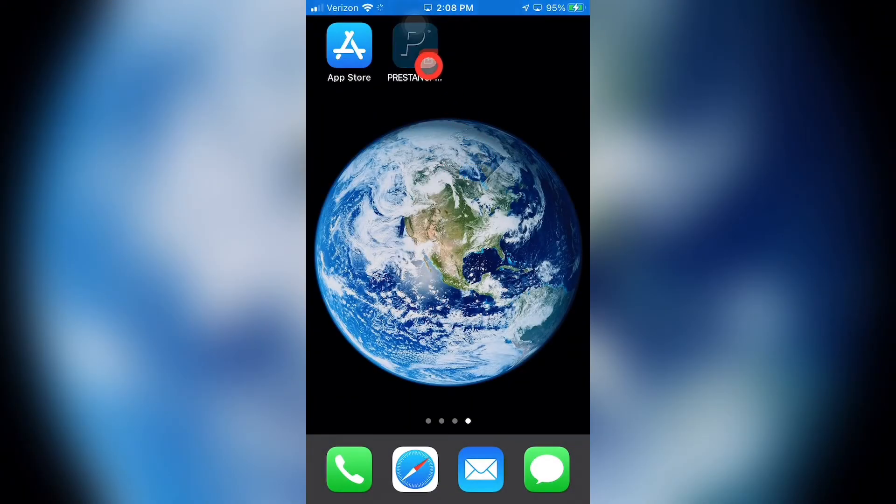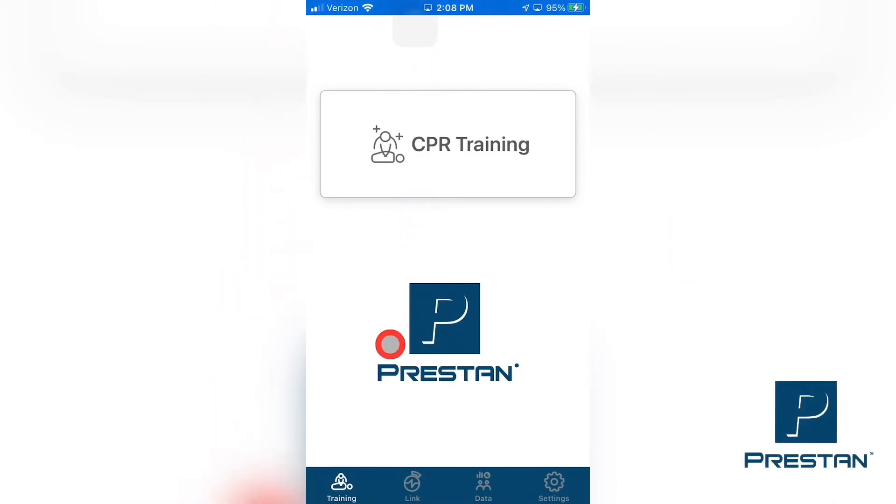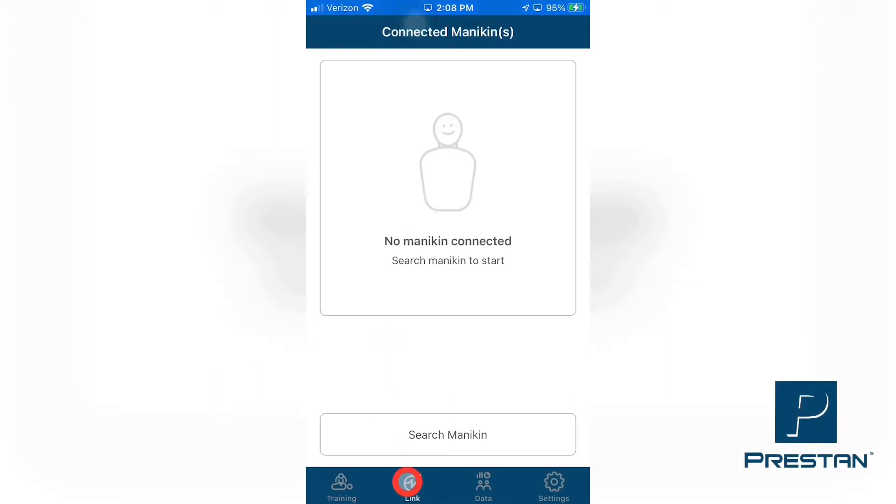Open the Preston CPR Feedback app on your smart device and select the Link tab found at the bottom of the Preston CPR Feedback screen. Select Search Mannequin.